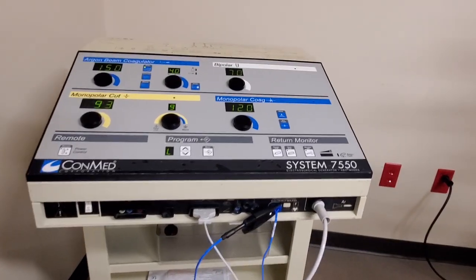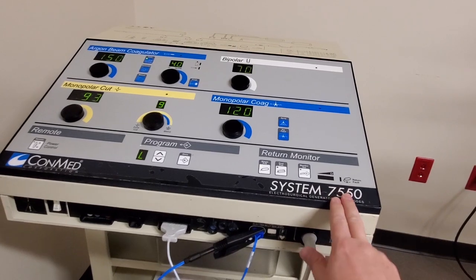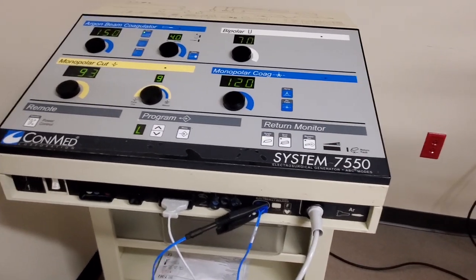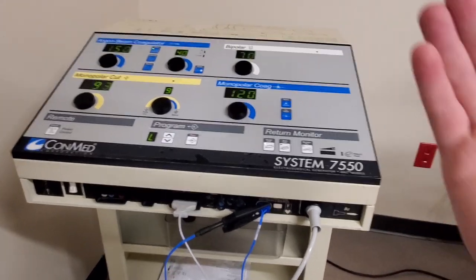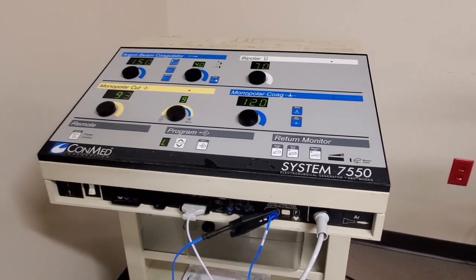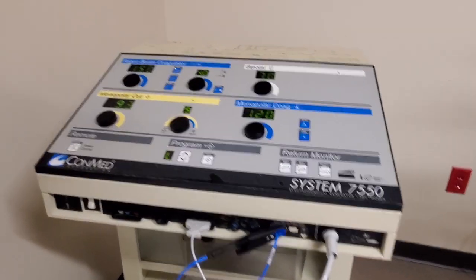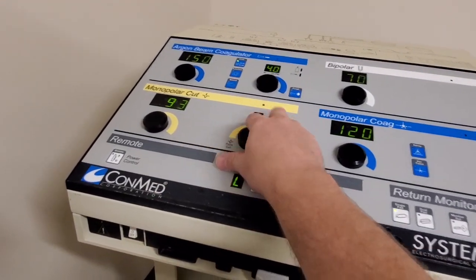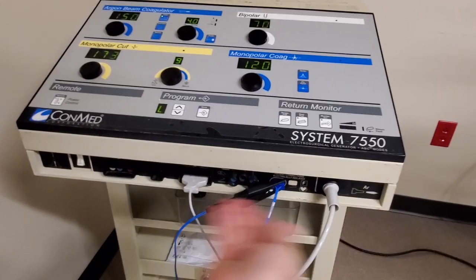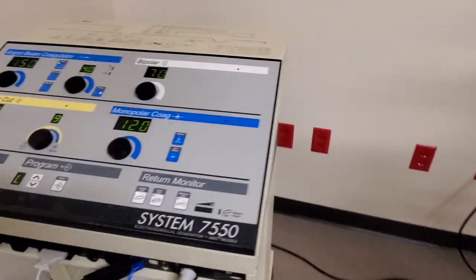I believe this unit is probably at least 10 years old. This is a System 7550; the other one you'll see is a System 7500. This is the updated version, which means the REM circuit isn't quite as sensitive as the old version. As I just found out, this unit is also no longer supported — it ended its life back in December of 2019. And here we are, it's still in service because it's such a workhorse. It's got a lovely layout with giant buttons, very easy to read and easy to attach gear to the front. The only real downside is it takes up a bit of operating room real estate.